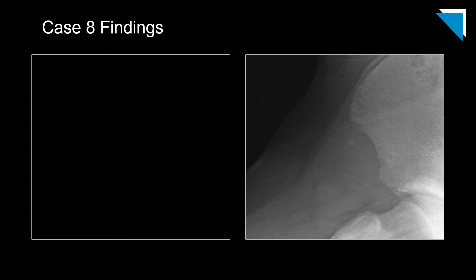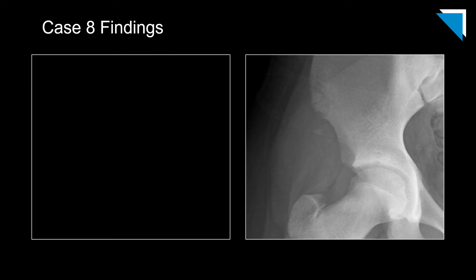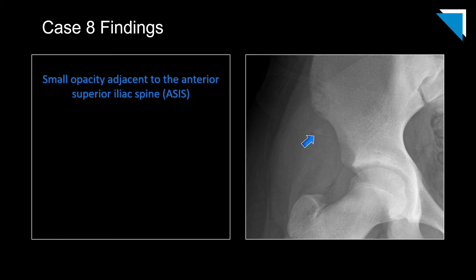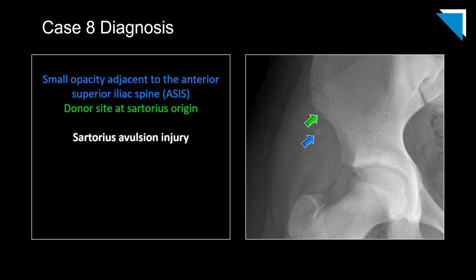This next case is a 13-year-old boy status post baseball slide who collided with the plate. Here is the frog-leg lateral view of the hip, coned down, and the corresponding AP view, also coned down. There is a small opacity projecting along the undersurface of the anterior superior iliac spine — an easy finding to miss or mistake for something in the overlying soft tissues. Upon closer inspection, we can see a small donor site in the anterior superior iliac spine at the sartorius origin. This is a sartorius avulsion injury, which results from forced extension of the hip.